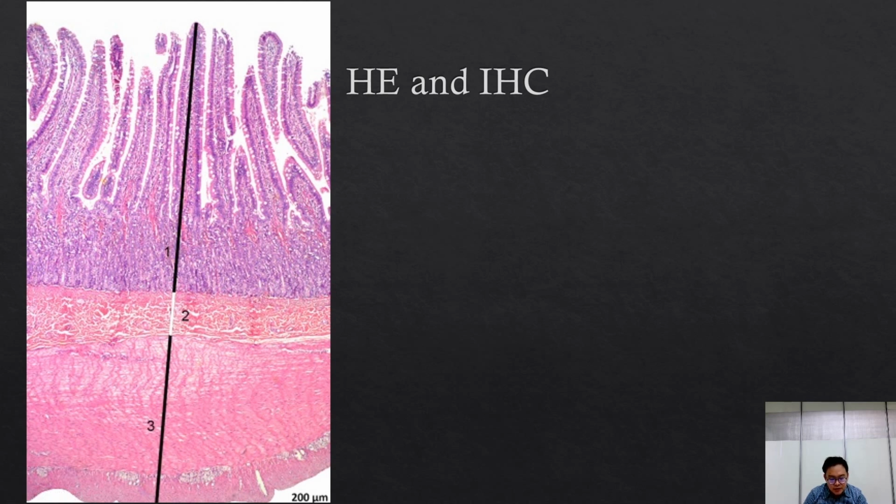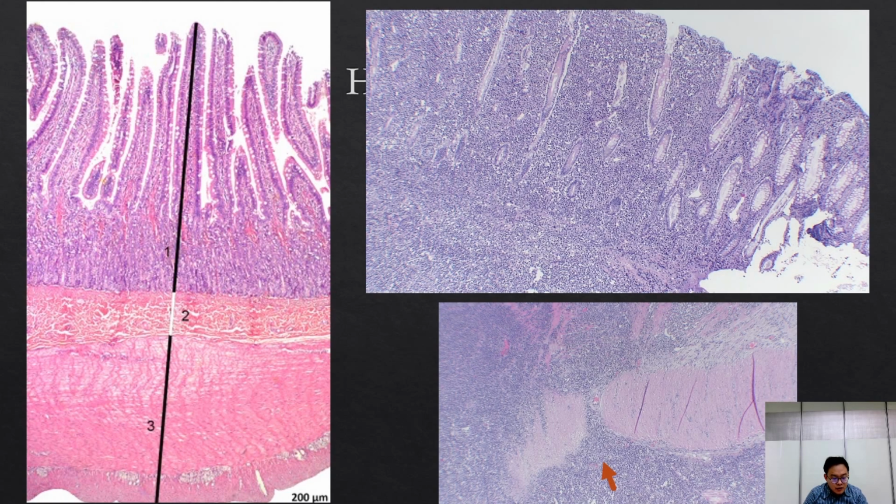In this case, you can see some remaining spaces between some villi, but there are a lot of tiny blue cells instead of normal villi, which is what lymphoma looks like in the intestinal tract. You can see the tumor cells infiltrated in the lamina propria of the mucosa here. And the arrow indicates here that the tumor cells had already invaded into the muscle layers.